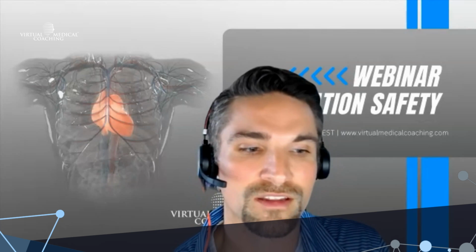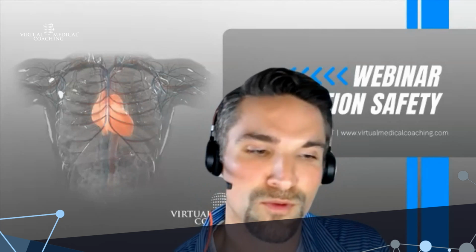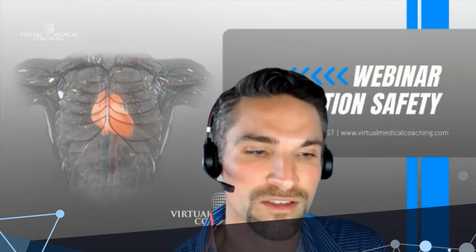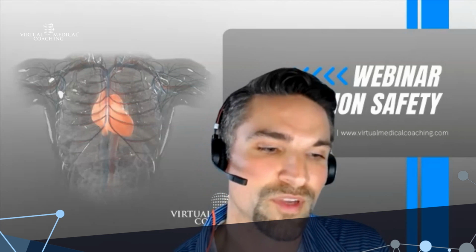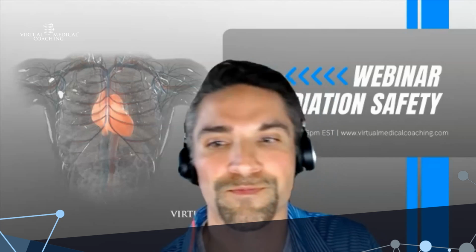The other thing I would just add, with the whole DAP or the dose area product, most patients are getting these doses submitted into their electronic medical record. Down the road, how that's going to change, maybe I'd have to defer to an RSO, but I could foresee maybe something in the future having these accumulations of these milligray doses in their chart, and then seeing if they get any pathologies in 10 years, 15 years, and then tying that data all together, which is what I'm talking about with this data. It'll be interesting to see, 15, 20 years from now, how all of this can correlate together.